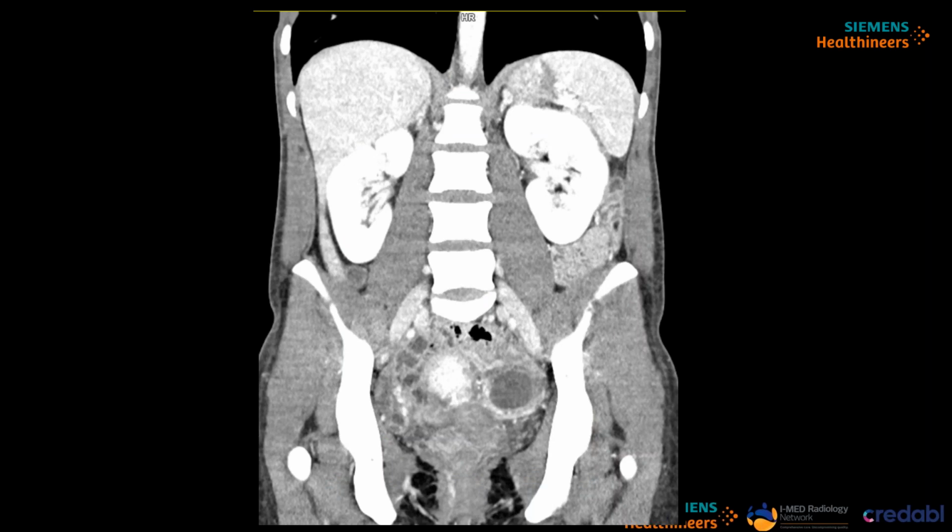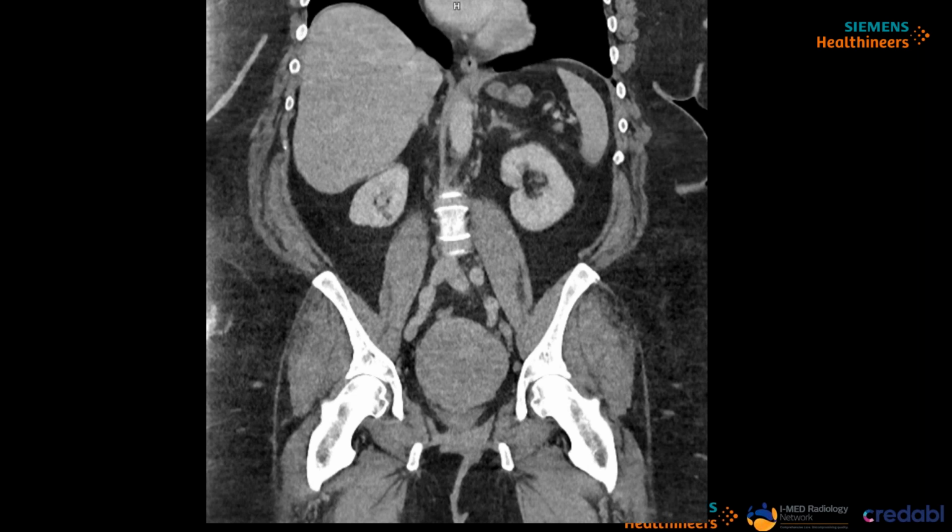So I've got some examples here. This abdomen pelvis was scanned at 70 kV with only 70 mils of contrast, and it's basically undiagnostic in the sense that their kidneys are lit up like a Christmas tree. Then we go to the other end of the spectrum. This was scanned on 130 kV with 100 mils of contrast, and it's barely even noticeable that we have any contrast in there. They were 168 kilos though, so.